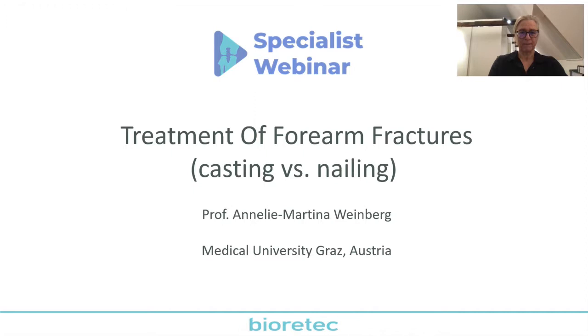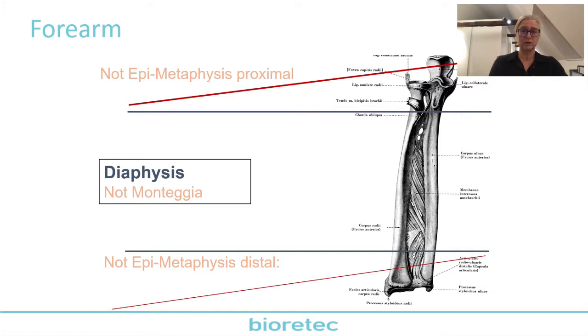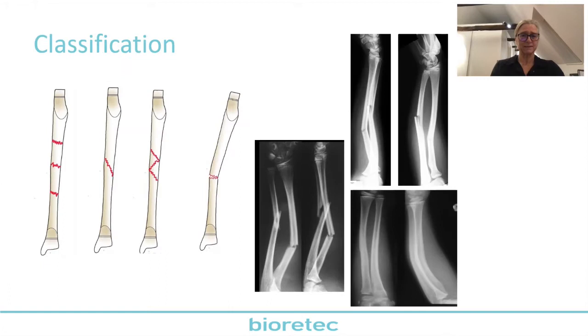So about what we are talking today, we are talking about the diaphyseal forearm, which means it's the square of the physis distally where the diaphyses start, and we are not talking about proximal radius fracture or proximal metaphyseal fracture of the ulna. So really about the diaphyses of the forearm. Next slide, please.